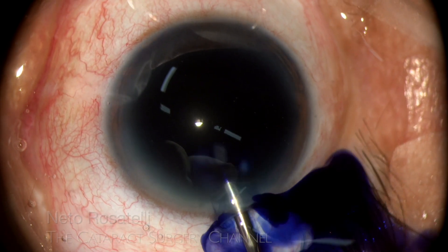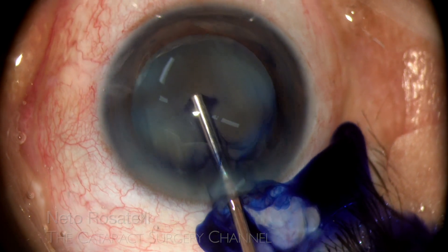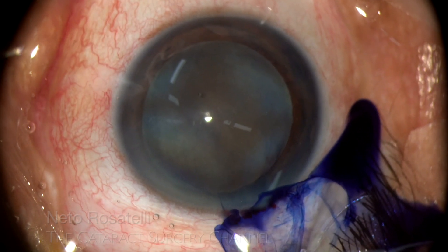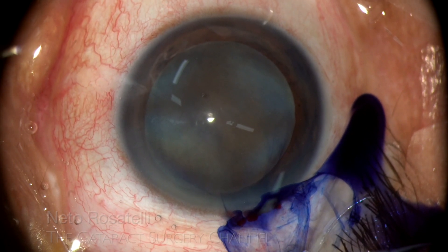0.5% lidocaine and trypan blue are injected, and a nice wave of dispersive OVD removes the excess dye and we can get to business.